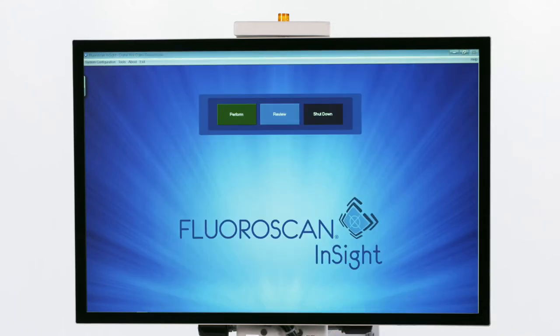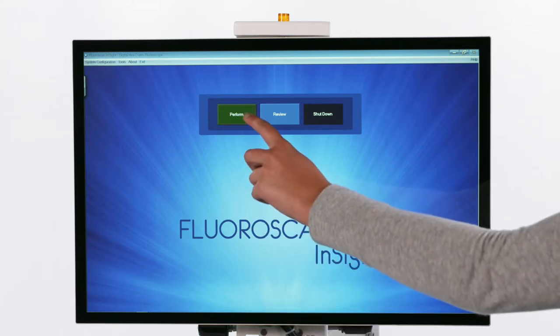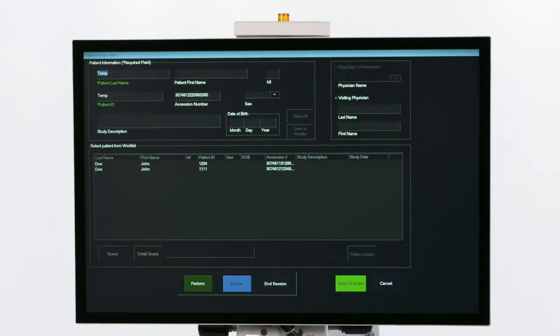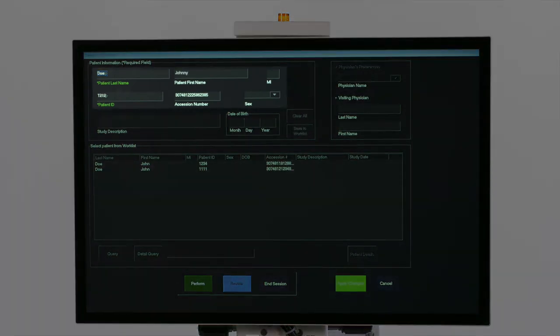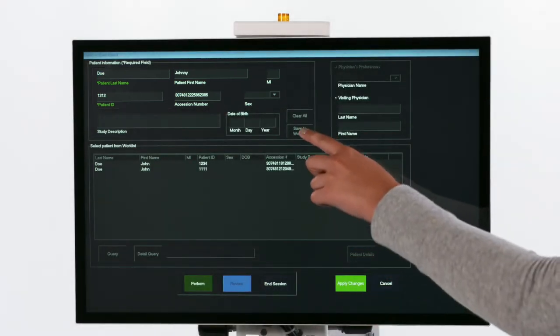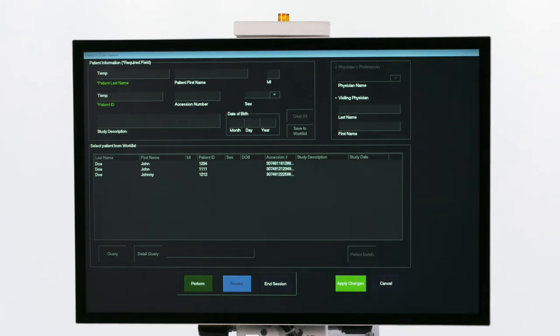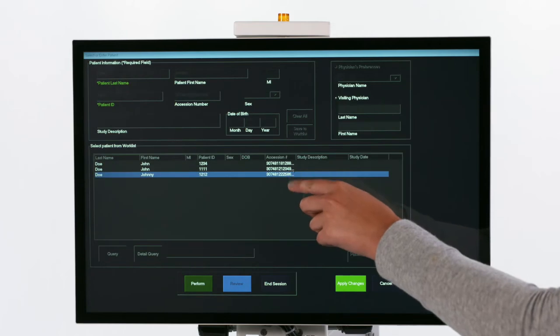To start taking images, click the Perform button. Using the touchscreen and keyboard, type in the patient information, which will require a last name and patient ID number. Then click Save to Worklist. Lastly, click Perform to display the image acquisition screen.